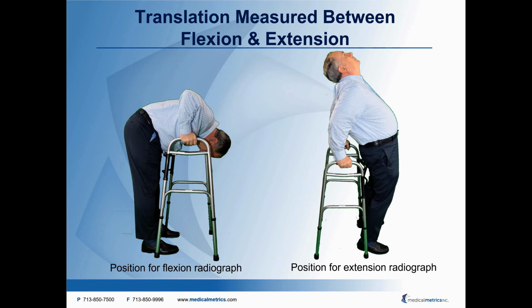There is a key limitation to using SPSI in clinical studies. The limitation is that the patient must exert very good effort when asked to flex and extend for the flexion and extension radiographs. The flexion and extension positions must mechanically stress the spine, to the point where the disc and ligaments would keep motion within normal limits, if the disc and ligaments are functioning normally.